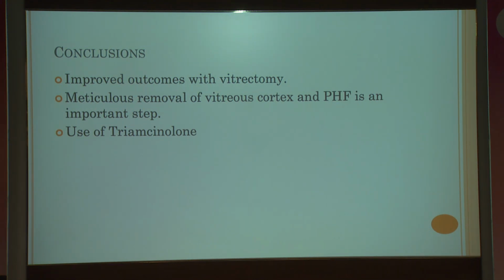So in conclusion, we see that managing foveoschisis is a lot simpler. One need not worry too much about the ILM. I've seen in most of my patients, I've never peeled an ILM, and it does work. Only in macular holes do you need to peel the ILM. I think that's the key to it.